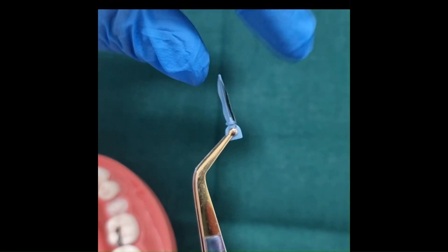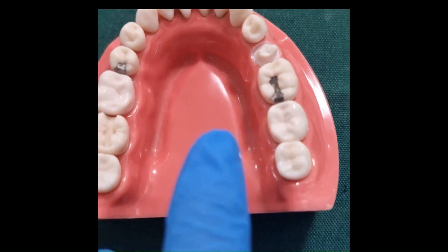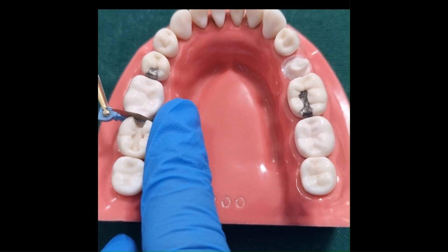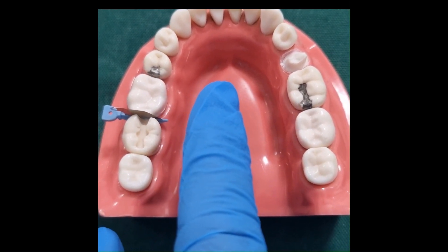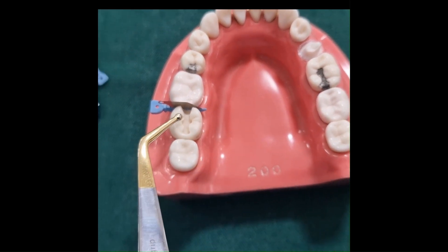Before we start the cavity preparation, a wedge guard can be placed in the interproximal space using a pin tweezer. This guard can protect the adjacent tooth from getting damaged.